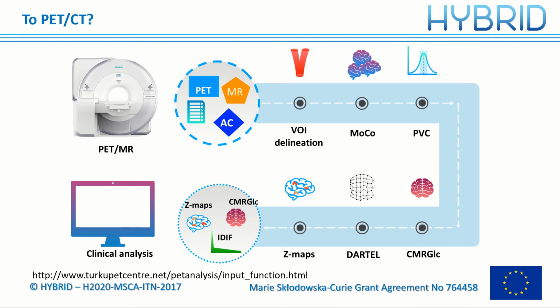To accomplish this task, the key points of the pipeline are extraction of the blood pool region to derive the input function; motion compensation, in fact, the patient moves the head in the scanner, causing artifacts and errors in the estimation of the glucose maps; and partial volume correction, a problem related to the resolution of the PET data that needs to be corrected.